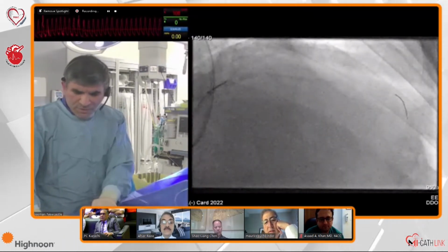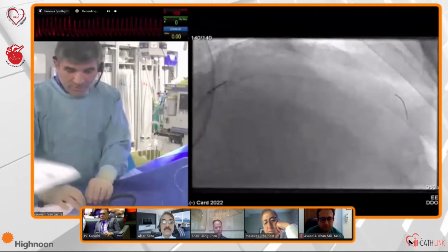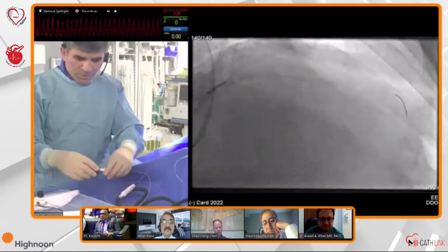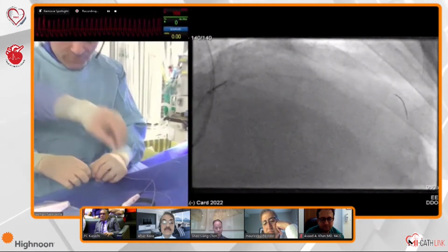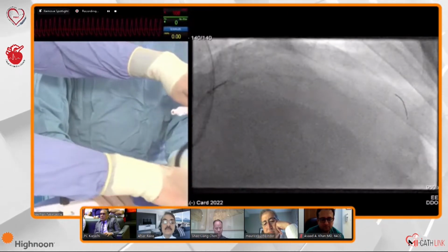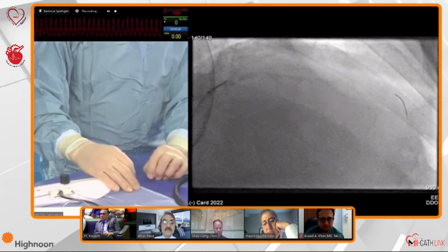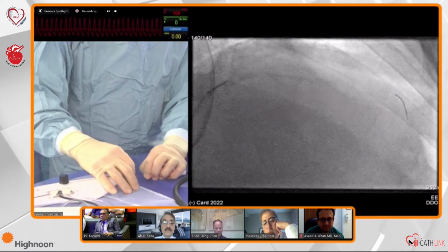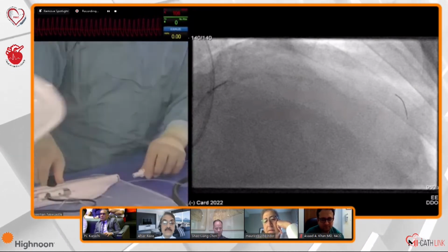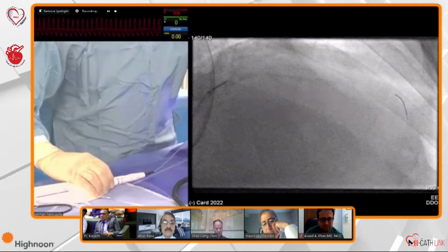But I think this was in the era where we didn't have the dual antiplatelet therapy and all the preparation that we have currently, so it's probably outdated. But I would still advise, for the bigger burr, to be a little bit conservative and not go too high. Probably 155, 160. I would accept that, but no more. 100%. Just open the drip for me, please.